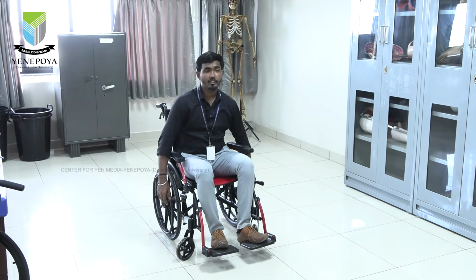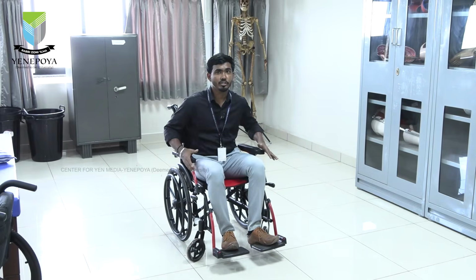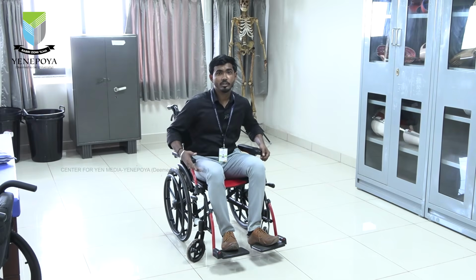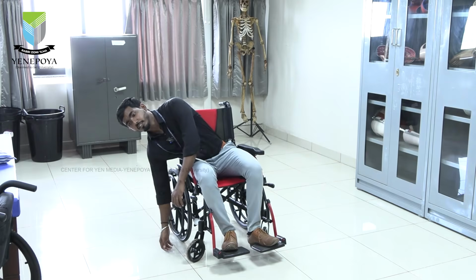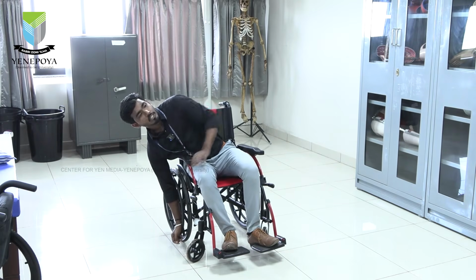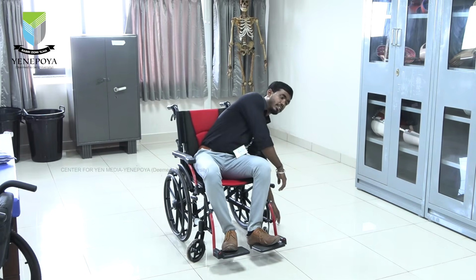There is another relieving technique nowadays. It has become very common because the previous one needs more strength for the person to push up, and sometimes it takes more time. So what we are telling nowadays is to just lean towards one side. If we lean towards the right side, our left gluteal muscles get popped up, so that gives the person relief. Do the same thing towards this side also.